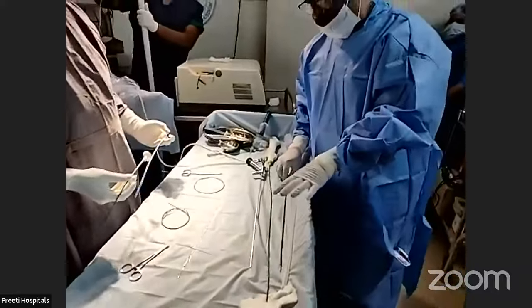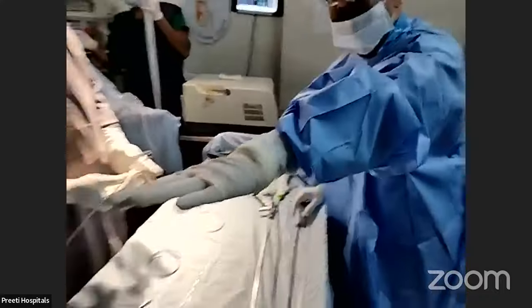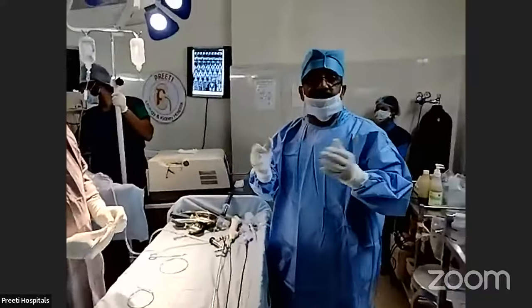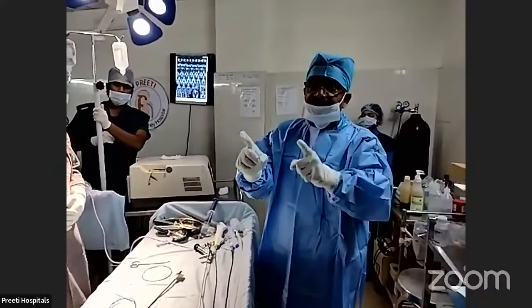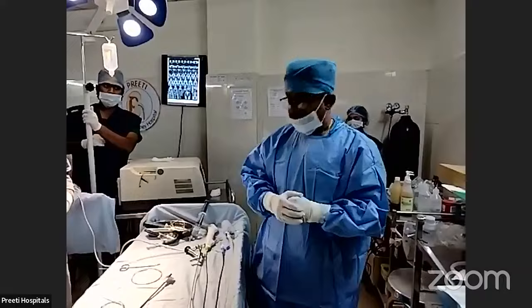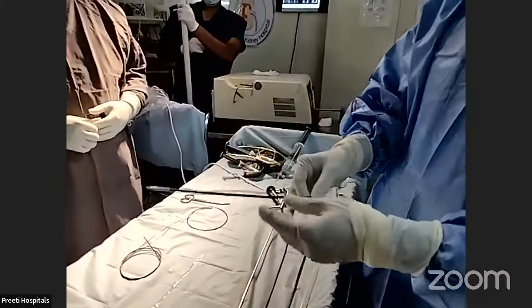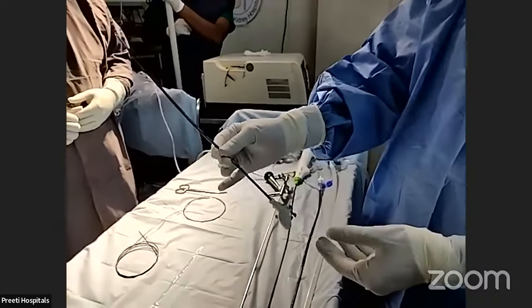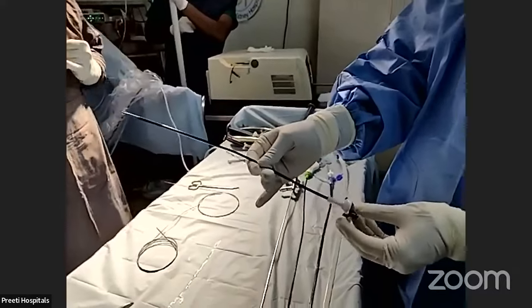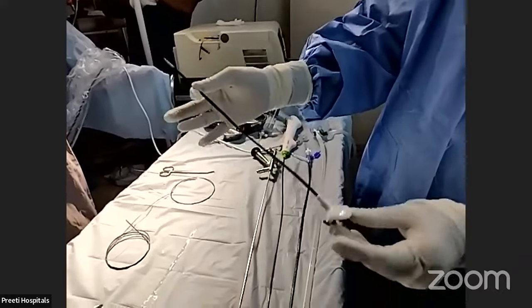So these two tables is because you keep minimum here and some extra there, so that if it is not used, sterilization you need not change. That is the main purpose. Otherwise, one instrument sterilization costs a lot. Now, normally we use a 28 centimeter access sheath, Cook company, which costs around 7,000 rupees, and this is 6,000 rupees, and this is 28 centimeter.